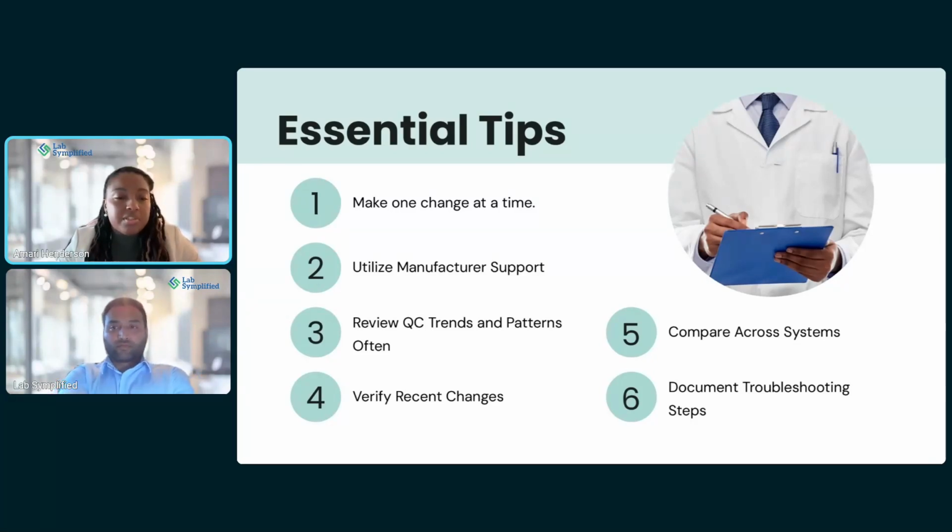So utilize your manufacturers, contact them, whether it's the quality control manufacturer that you want to start with or your instrument manufacturer. Let's use that support there, and maybe they are aware of a similar issue that another customer called in about. So I think that's extremely important.